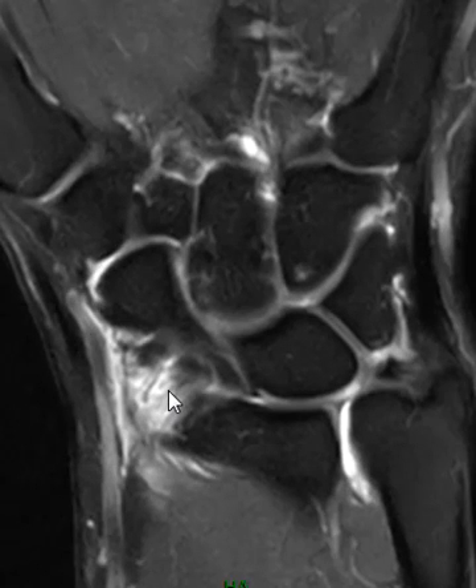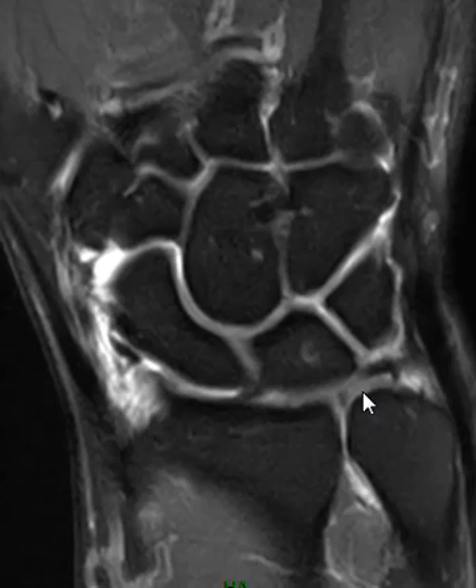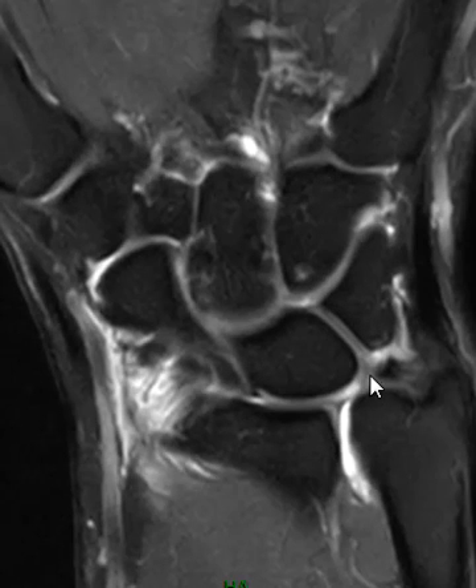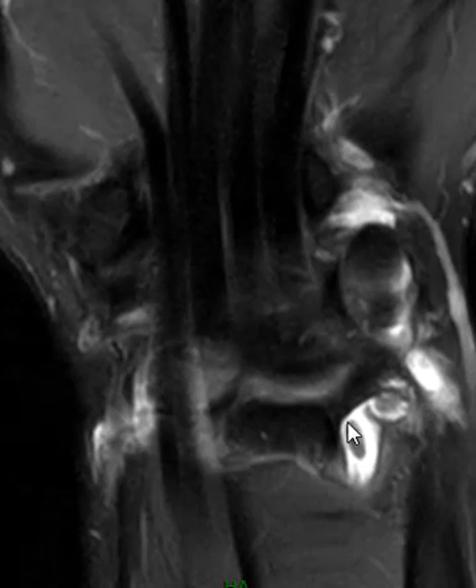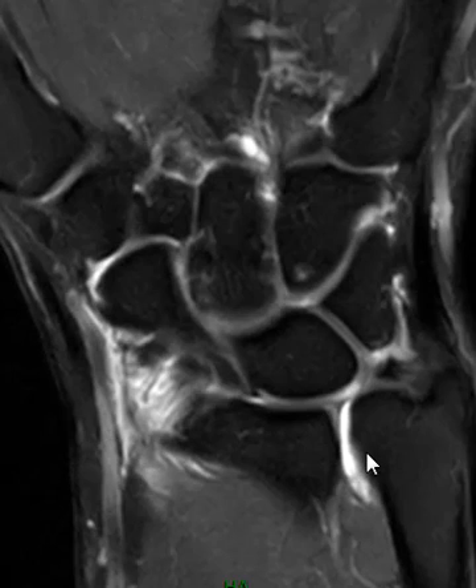The patient had a prior injury. Before I go to the sagittal view, you can see they have a large tear of the central TFCC with fluid going into the distal radial ulnar joint. They also have this little ovoid loose body here in the TFCC.